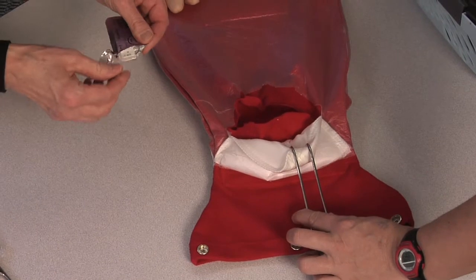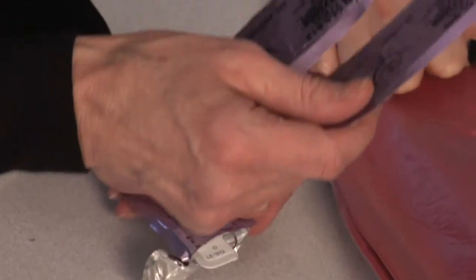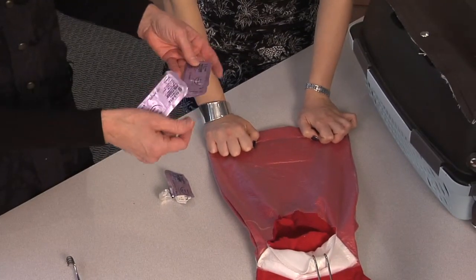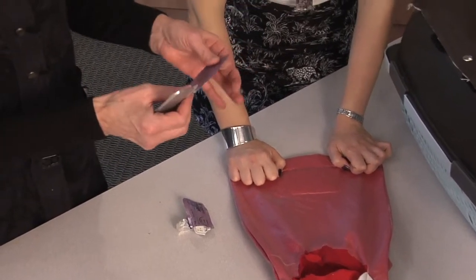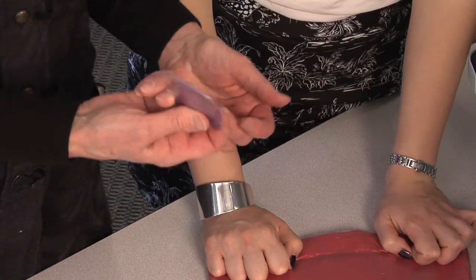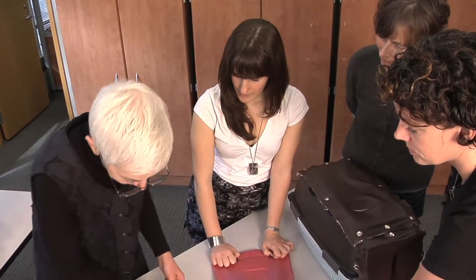We're going to open the sutures. I take expired sutures — they've got a date on them, just like your yogurt or milk at home. The nurses save them for me. Also, sometimes they've been opened, and in most North American hospitals there are two wrappers around all of these. Once the outside one's gone, it isn't considered sterile anymore, so it can't be used clinically — but it's still good. These ones actually came from the Ottawa Hospital from the workshop last week.